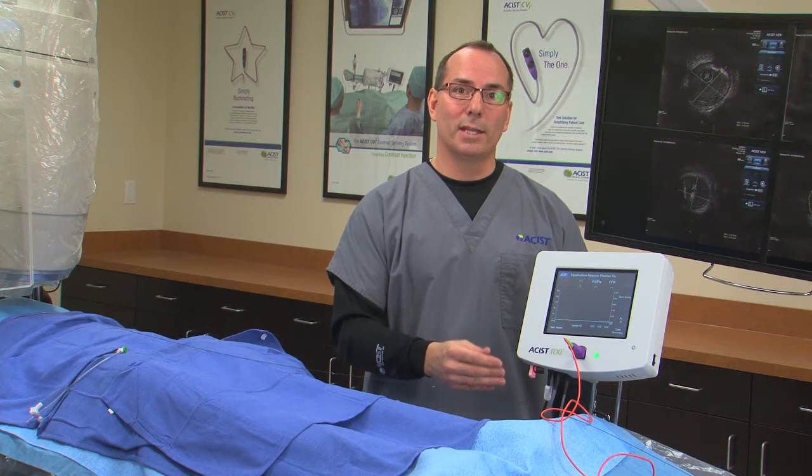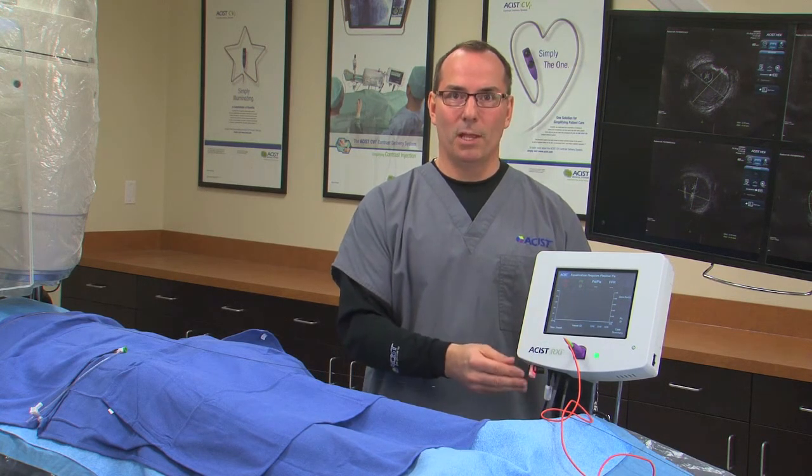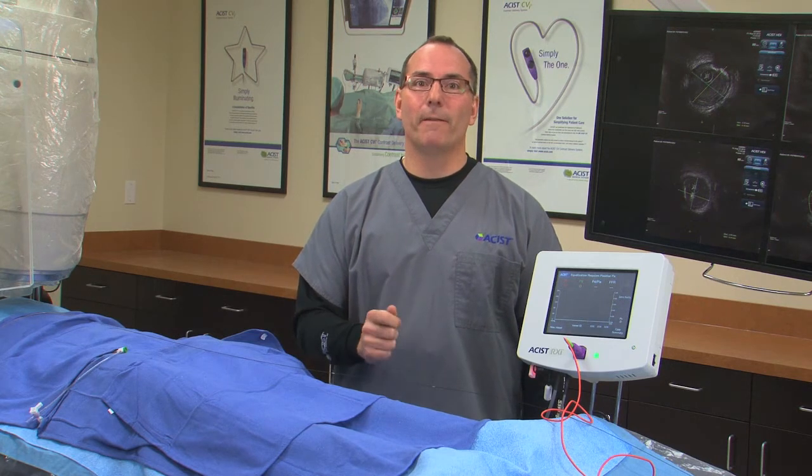So then we can see the pressure waveforms of the patient on the system. The third cable is actually for exporting the Navvus catheter pressure into the cath lab hemodynamic system. This becomes important when the cath lab hemo system has the FFR software.